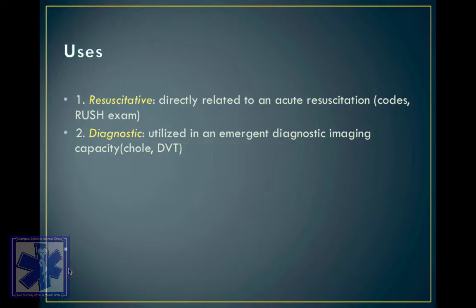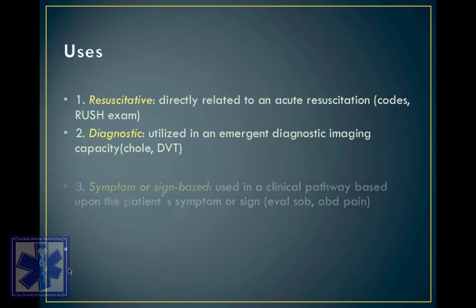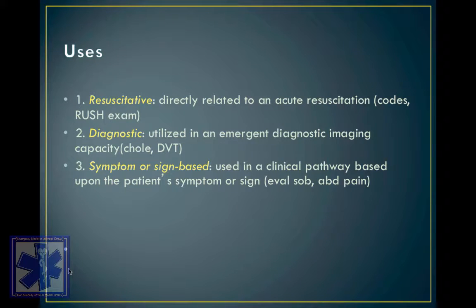Looking for diagnostic purposes. Does this person have an acute chole? Do they have a DVT? Something I need to intervene on? They come in saying I'm short of breath. How do you work that up using ultrasound as a diagnostic modality?